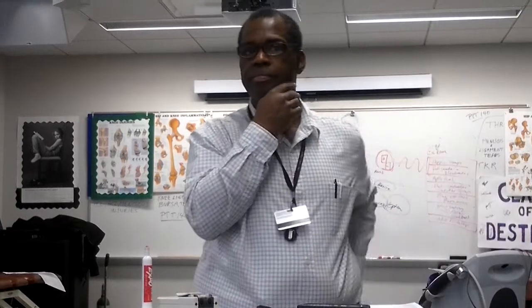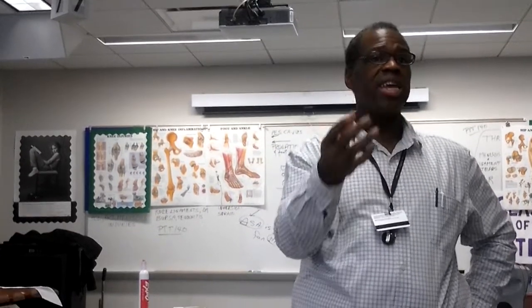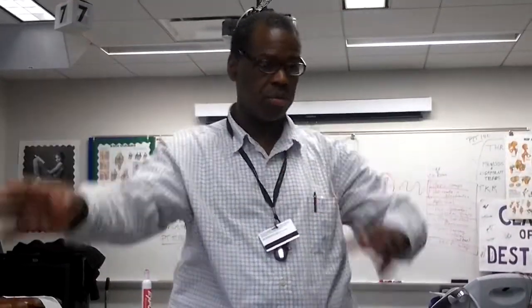All right. What is a channel or what is a lead? What does that mean? A lead is a wire, the delicate wires. A channel is just what everything comes out of, or a jack. Channel 1, channel 2. It's just a jack of what everything comes out of.